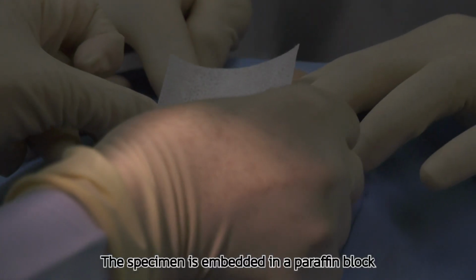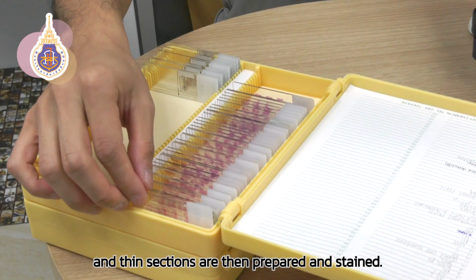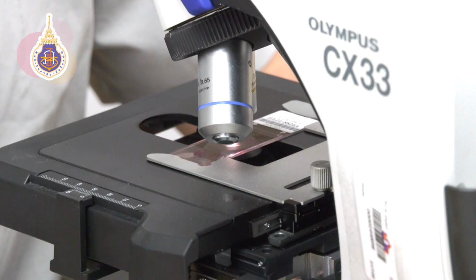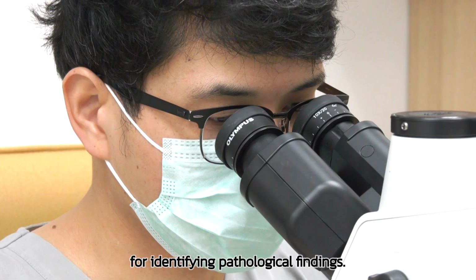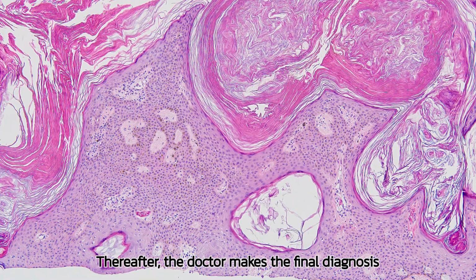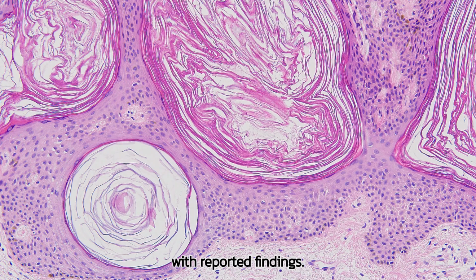The specimen is embedded in a paraffin block and thin sections are then prepared and stained. These sections are examined under a light microscope for identifying pathological findings. Thereafter, the doctor makes the final diagnosis with the reported findings.